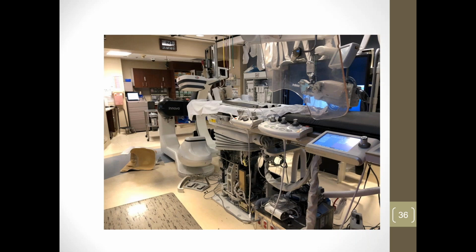You don't want to be right up on the patient's chest, and then you don't want it so far away that your images are like this big on the screen. So not having that working was not acceptable. And then also the table decided to quit working as well.